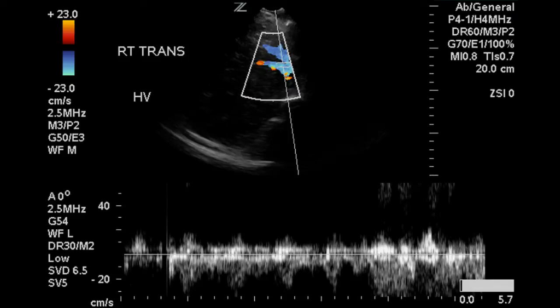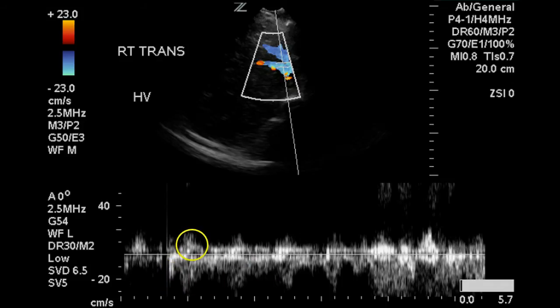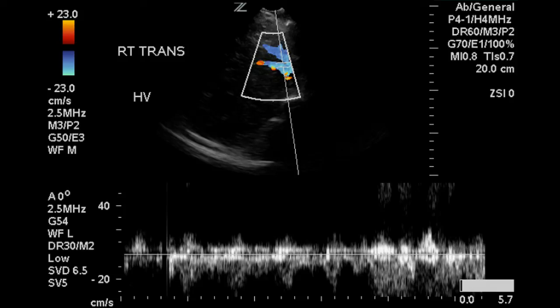This is a Doppler waveform of the hepatic vein — it appears to be the right hepatic vein. We can see flow downward and a small amount of reverse flow here, and this is the atrial kick.